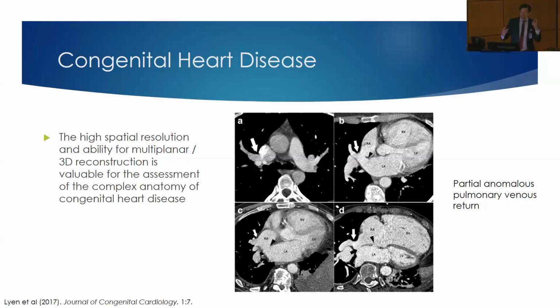as well as a 3D post-processing reproduction of the structure of the heart that can tell you what's connecting where. Because sometimes from an echocardiogram, you're just given a certain set of images and you can't really get an idea where things are connecting, and you can be very inconclusive in your echo reporting. But the CT can help clarify things.